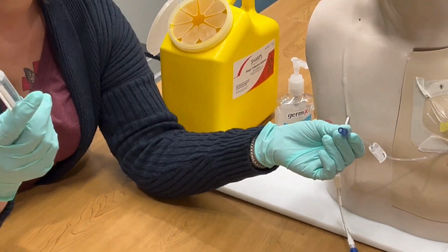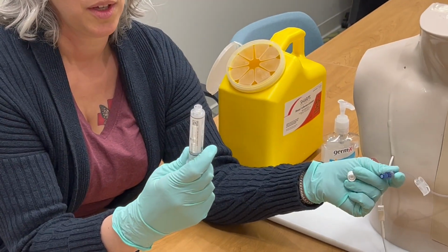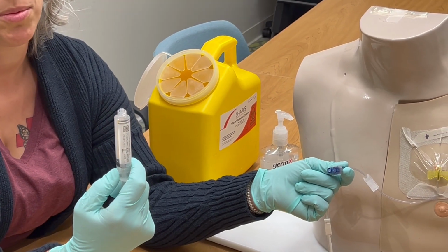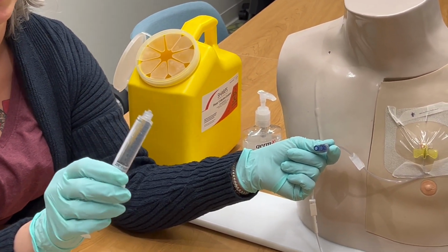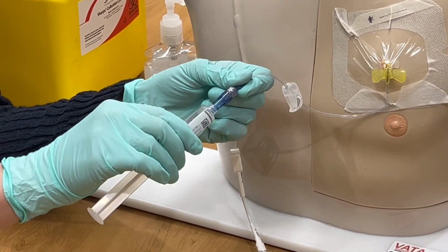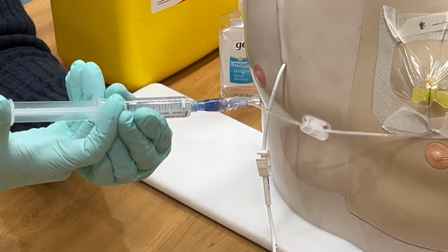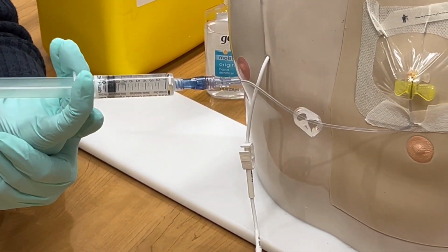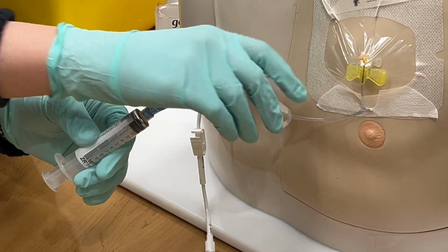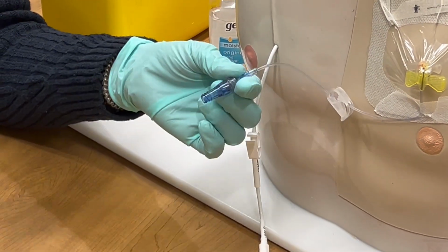While that's drying, you're going to take your saline flush, take the cap off, pull down on the plunger to break the seal, and then slowly push up to push the air out and see a drop of fluid come out the top. Next, you're going to push and twist the syringe onto the end of the needle. Open up your clamp, and then you're going to flush with a push-pause technique. Next, we're going to close the clamp. Then we're going to untwist the syringe and put it in the waste bucket.